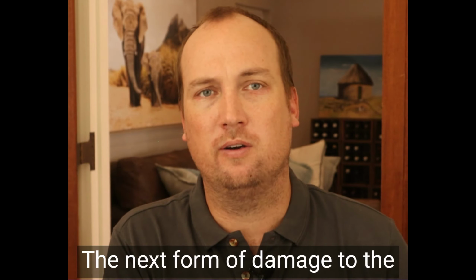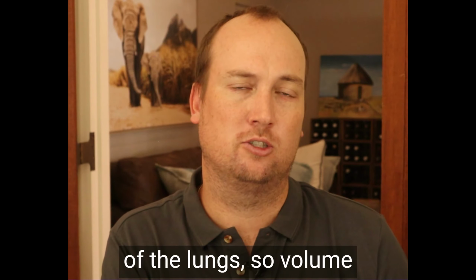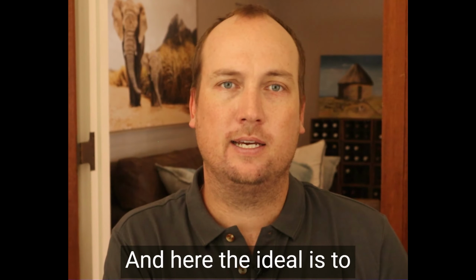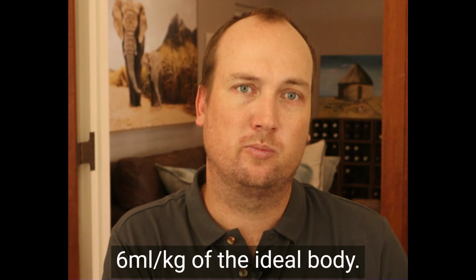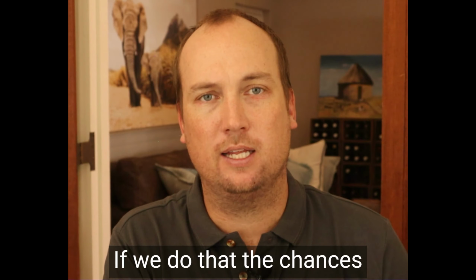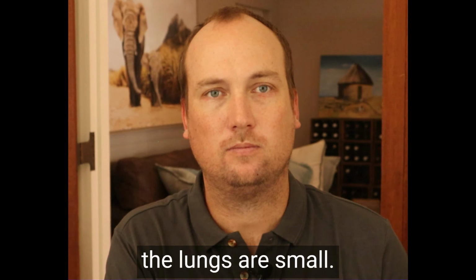The next form of damage to the lungs can be overexpansion of the lungs, so volume-related trauma or volutrauma. And here the ideal is to aim for a tidal volume of 6 mils per kilogram of the ideal body weight. And if we do that, the chances of volume trauma to the lungs are small.